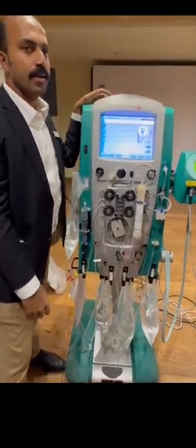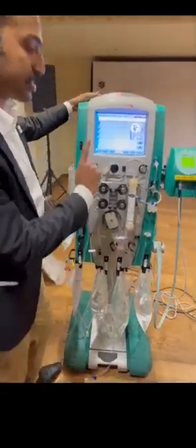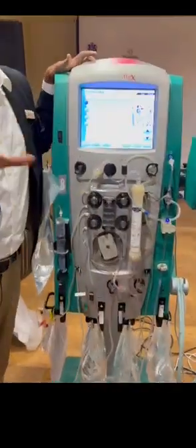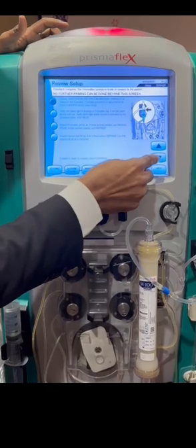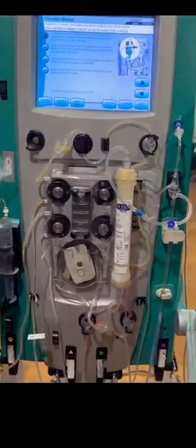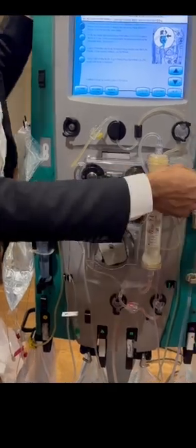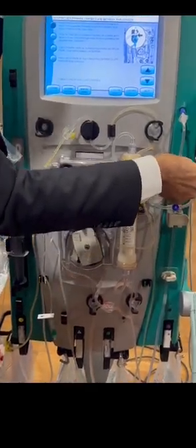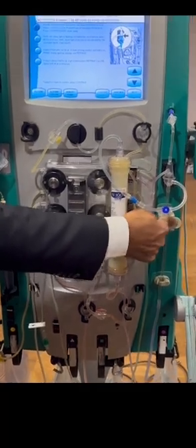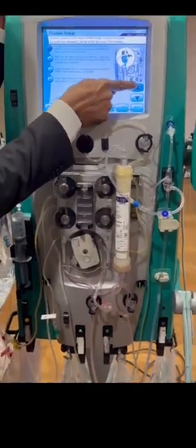So we can do the MARS with this machine only, no? This machine only. We have to attach that MARS monitor with this machine. Now the test got completed. Okay, test completed. Now we have a chamber here. Okay, this we can adjust, because if little bit air is coming, it will accumulate here. This is the deaeration chamber. If you are not increasing this, it will go to the over air chamber. Okay. We can adjust from here.